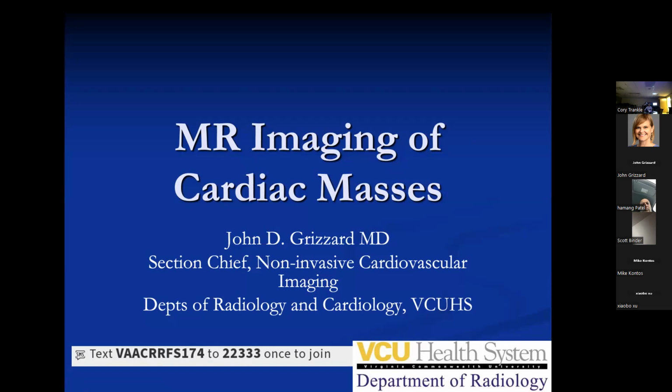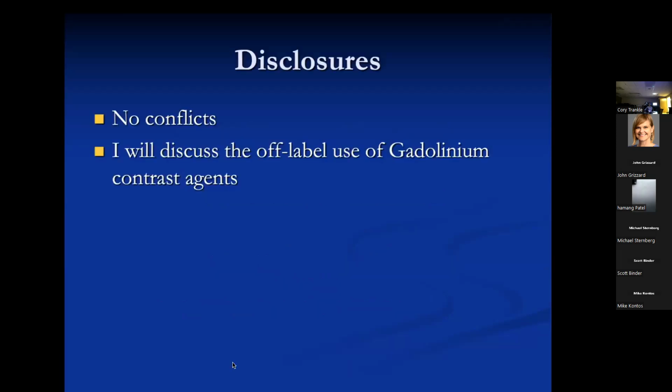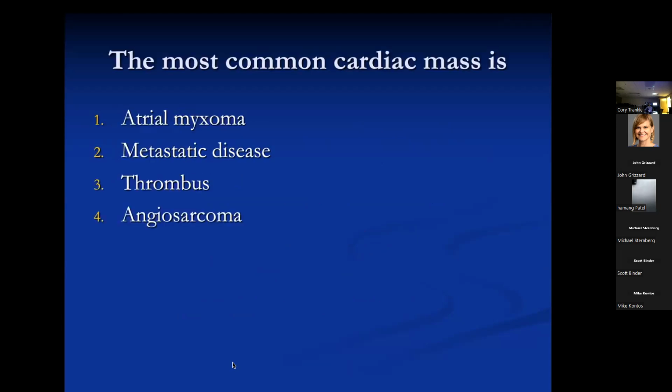We're going to talk about cardiac masses today, and it seems like a kind of uncommon thing, but a lot of things in MR, you add together small areas and they become substantial, sort of like pericardial disease and certain other things. And it's the most definitive test. So a lot of things that are confusing on other modalities end up coming to us. I don't have any disclosures, and we are always using gadolinium in many instances as an off-label indication.